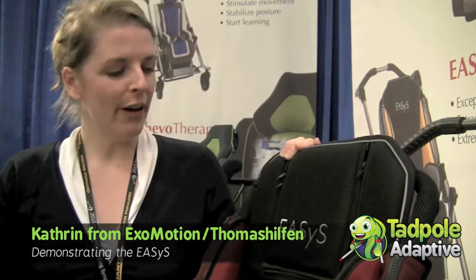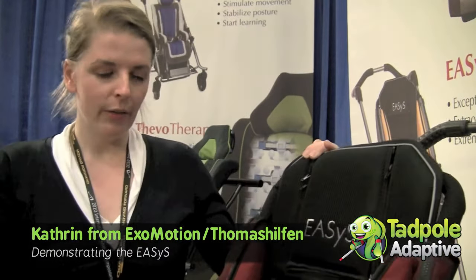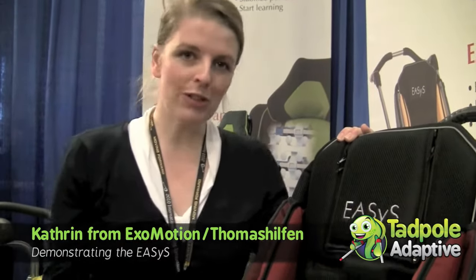I would like to show you the Eases now — a very nice and nice looking rehab stroller. We have a lot of different accessories for the stroller and a lot of possibilities to adjust it to the child. I'll just explain some of them.